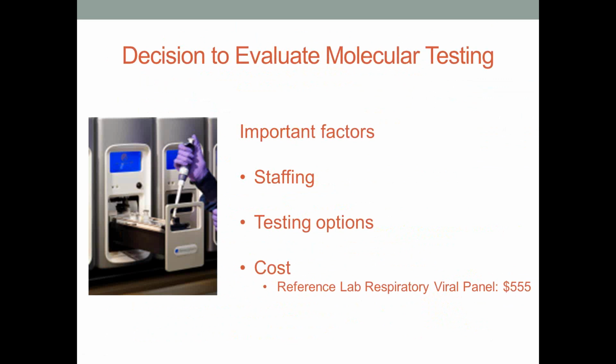So some of the factors we looked at when we were choosing what platform to bring in: we had periods of understaffing and, as I mentioned before, difficulty hiring techs. And the staff that we had in the lab had limited molecular experience. So we really needed something that didn't require extraction steps or a lot of hands-on time, something that could easily be incorporated into the workflow and that was FDA approved and not a lab-developed test.